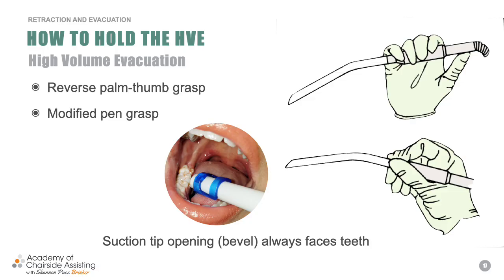When you look here at this photo, you see where my suction tip is, right? I'm looking at the pointed bottom of it. You see we're on the bottom, but think about that hole, and the top of that opening, the very top of the suction tip, should be even with the occlusal surface, okay? That will save you every time. Position that tip far enough back from the handpiece so that it doesn't draw the water coolant away from the burr too, okay?